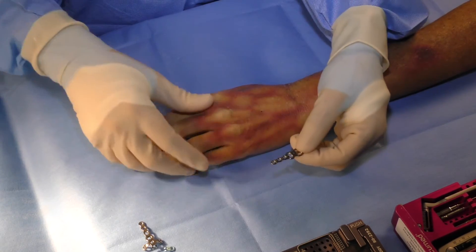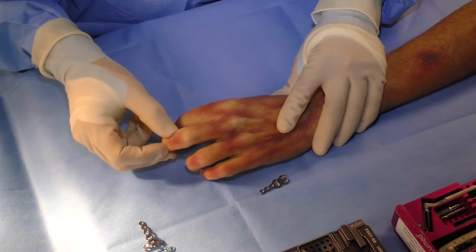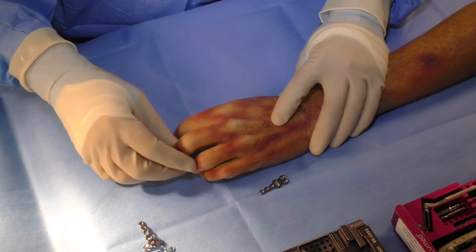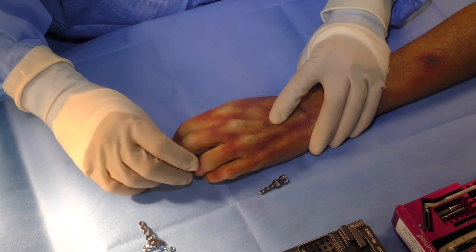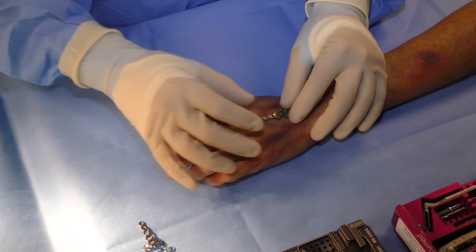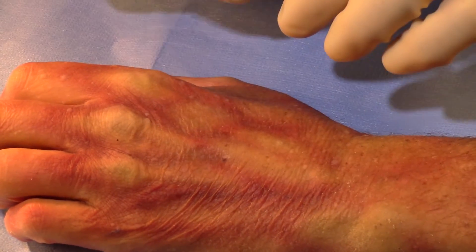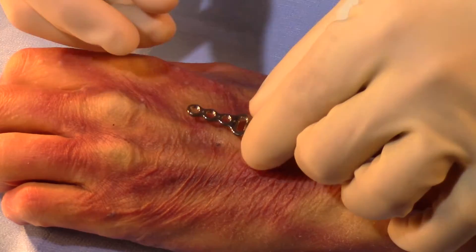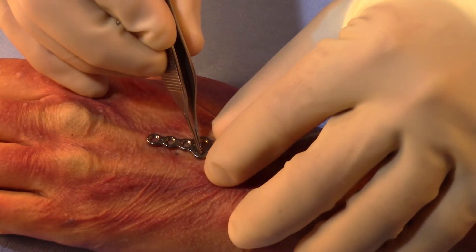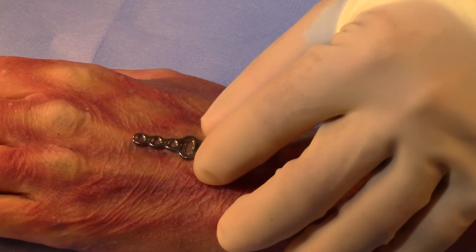Another unique plate is the metacarpal osteotomy plate, utilized when there is a malrotation of a finger after malunion of a fracture. Rotation can be corrected at the metacarpal to bring the finger back into normal alignment. The plate is positioned at the base of the metacarpal. By pre-drilling for the plate, a cutting jig is used to get an accurate cut, the plate is replaced, and quick control of the fragments is achieved. The oval hole allows the 20 degrees of rotation needed to correct the finger malrotation.